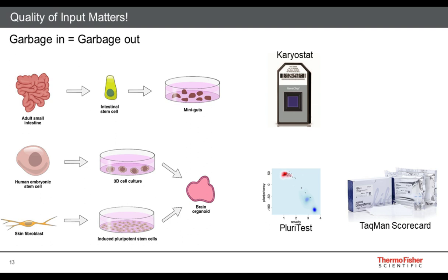And as it relates to pluripotent stem cells, checking to make sure your population of cells really are pluripotent is very important, so that you don't have some colonies of differentiated cells mixed in with your undifferentiated cells that may make it difficult to reproducibly generate the iPSC model that you're interested in. In other words, you don't have competing cell populations that may influence your model in a non-desired way.